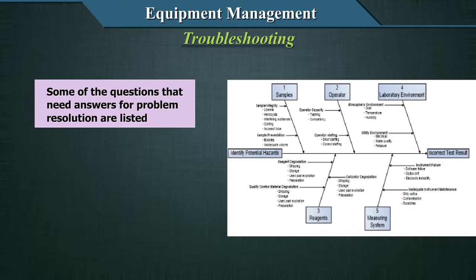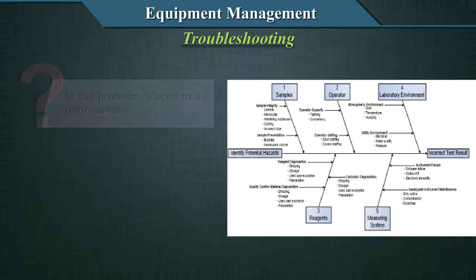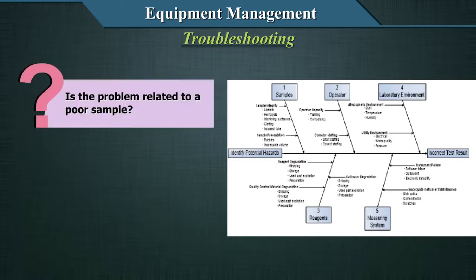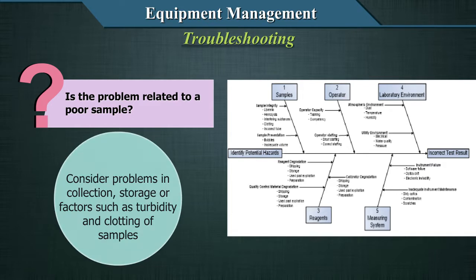So here, we are not just talking about the equipment. Equipment is just part of the problem. But whenever you are troubleshooting, you would consider all of these comprehensively. Is the problem related to a poor sample? Consider problems in collection, storage, or factors such as turbidity and clotting of samples.